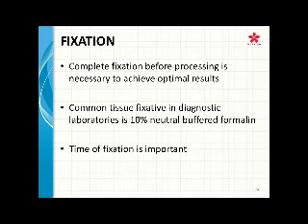We really want to make sure that we have complete fixation before processing. Having complete fixation before processing, let me rephrase that, is very necessary to achieve optimal results. And we know that fixation and processing are two completely different things. Fixation is whenever your tissue is being fixed prior to being put onto the tissue processor. The most common fixative in the diagnostic laboratory, as we know, is 10% neutral buffered formalin. The time of fixation is very, very important, like I explained with epitope retrieval. Hydrogen bonds are formed onto these antibody sites, and we have to unmask those for the reaction to happen.